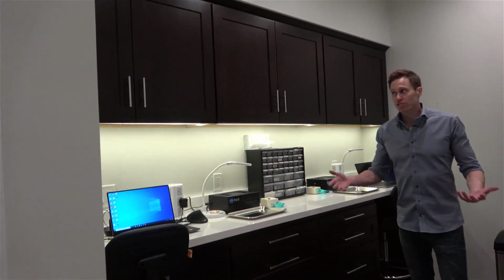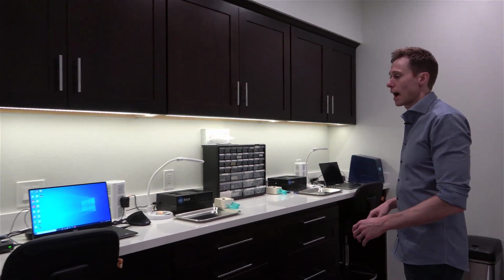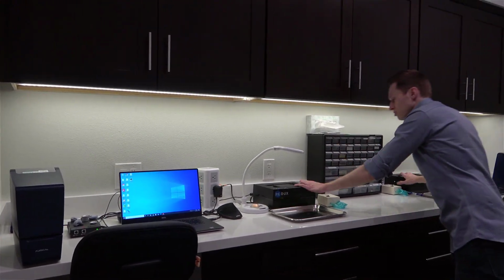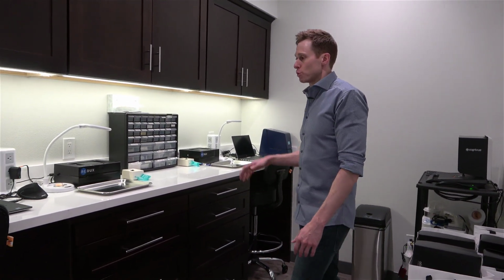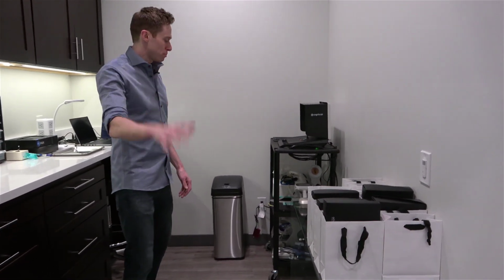And then over here, we have the work area, the workstation. So this is where we bring hearing aids to do repairs, maintenance, things like that. We've got 2 test boxes in here to run diagnostics on hearing aids. We've got 2 Redux machines, which are fantastic for pulling moisture out of hearing aids to save them from water damage, which we run all the time. We have a bunch of hearing aids here that are ready to go out to patients.